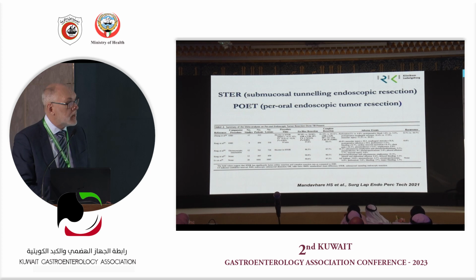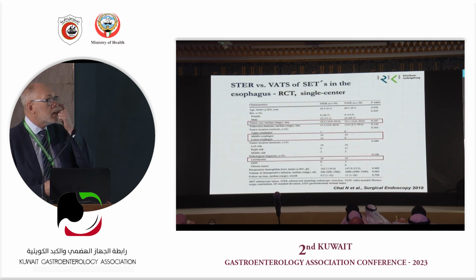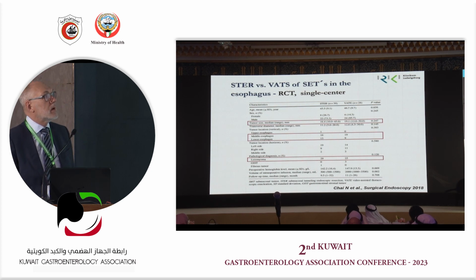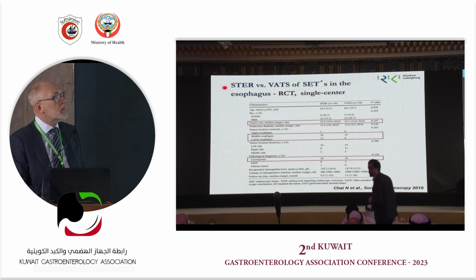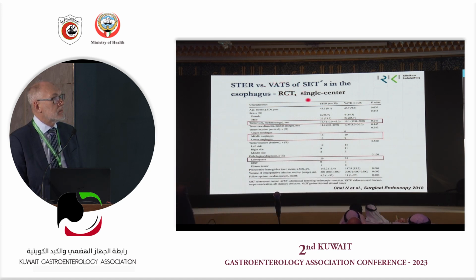There's a meta-analysis that showed pretty nicely that we have a technical success rate in the 90s and a complete resection rate in the upper 80s. And there was one benchmark trial from Beijing, looking at esophageal subepithelial lesions, comparing the STER procedure with a video-assisted thoracoscopic resection.